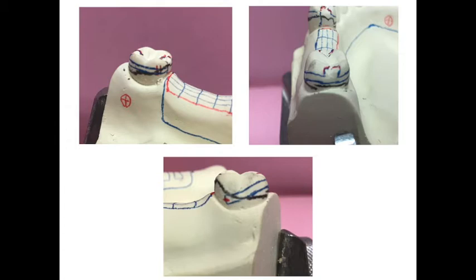That's why in the KISS principle, in the design manual, it says you should draw the clasp design first, and then draw the survey line later, because the clasp should be in the ideal position. The tooth morphology should be modified to accommodate that. If you draw the survey line first, it will definitely compromise your clasp drawing. Then that will make your clasp not workable.